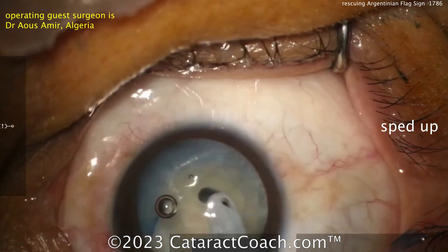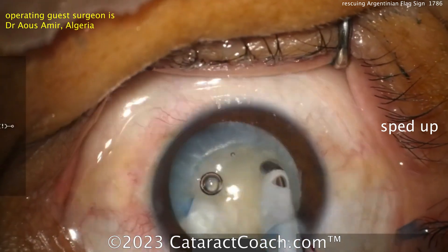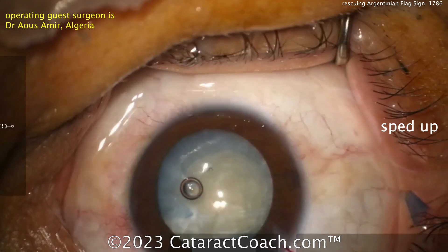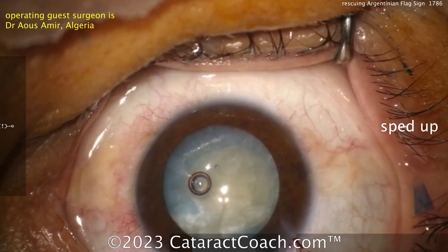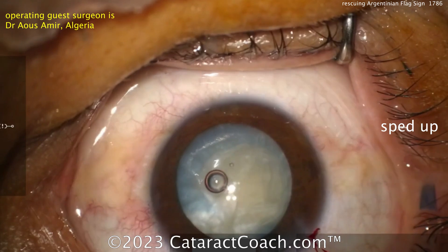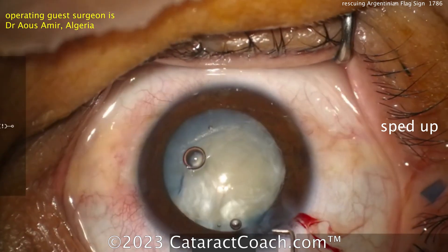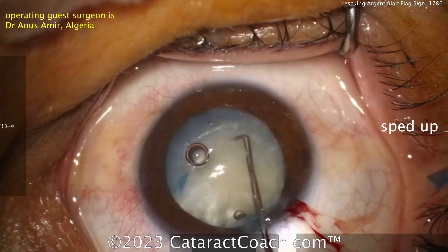Let's take a look — going with the IA probe, just aspirating to get out that liquefied lens material. That's a good move. In a case like this, maybe a double rhexis technique would have worked a little bit better so you didn't have as much of a risk for run-out, but it can still happen.